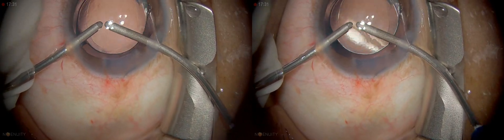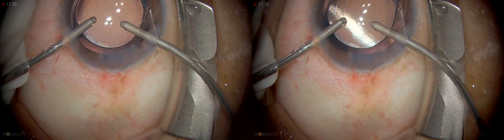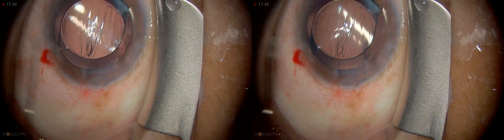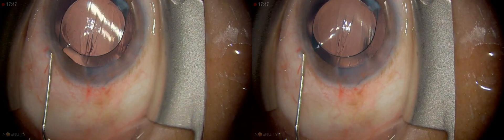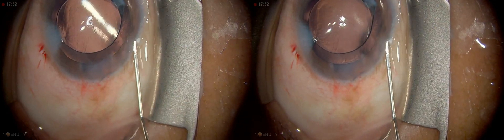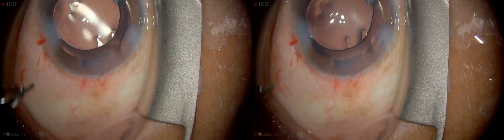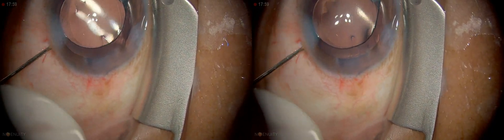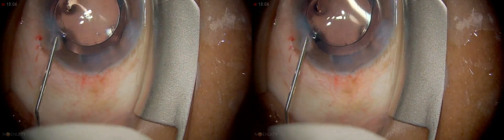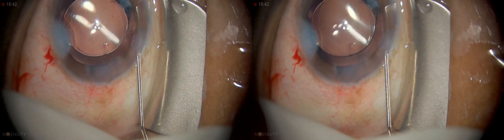I'm going to tuck the haptic in under that area of fibrosis and keep it like that. I'm going to reduce the pressure by loosening up the speculum so that pressure on the eye itself is reduced. You can see that when I do that the anterior chamber forms very well. I need to nudge the lens back into position. We've got nice cover — I'm going to seal the wounds, test its integrity, and then close up.